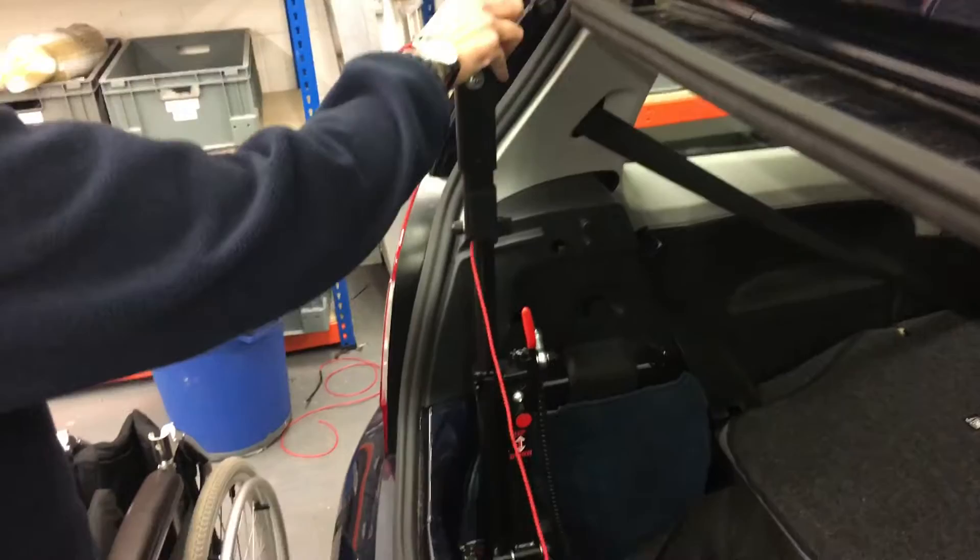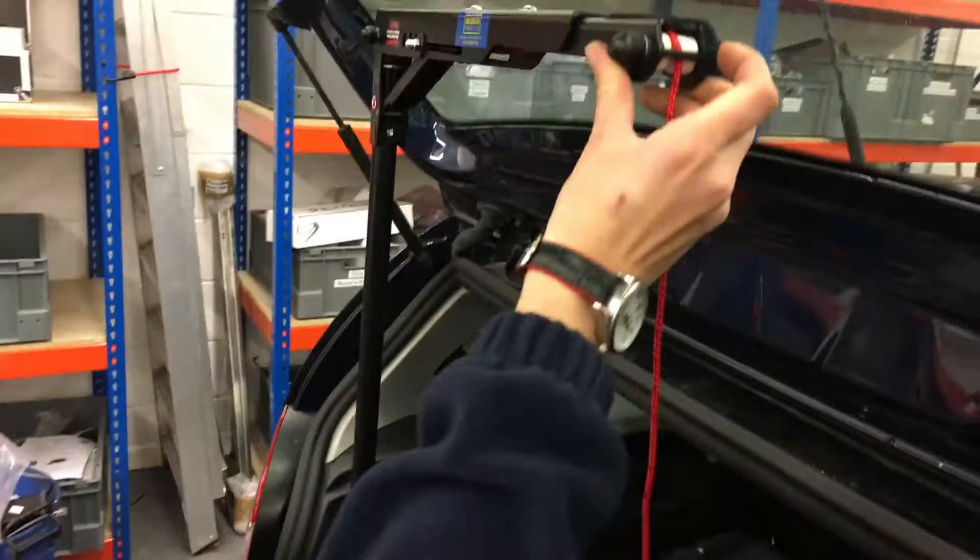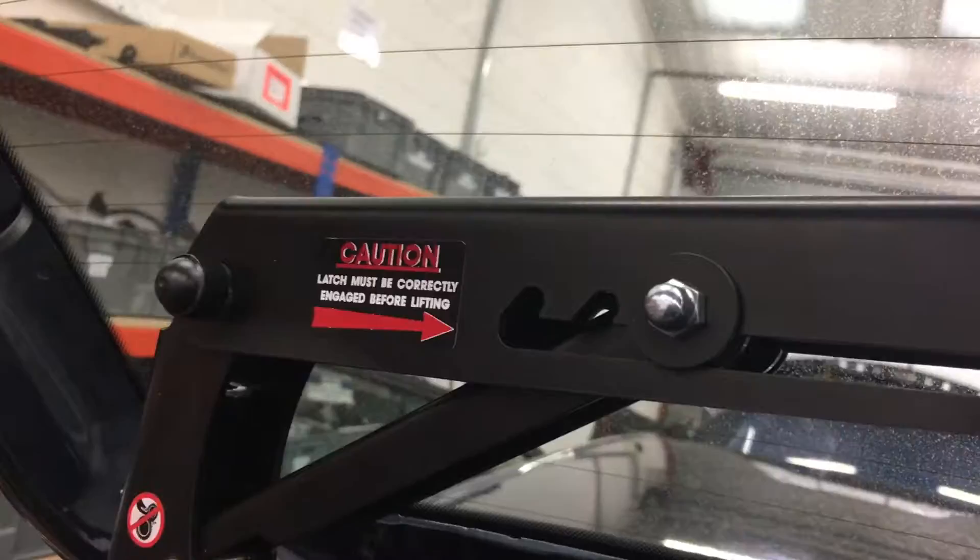Move the arm up into the vertical position, lock it into position with the red handle, and then pull the arm up — that clicks into position on a ratchet.